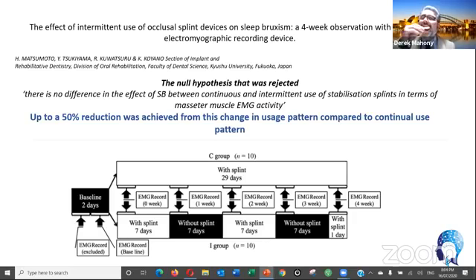So look, I wear one of these on top. Now, in theory, that could just be your occlusal splint, but then at the lower, that position really works for me because it stops me snoring, and I know that from not snoring. And I feel so much better. You know, when I did the sleep, I'll take this out.